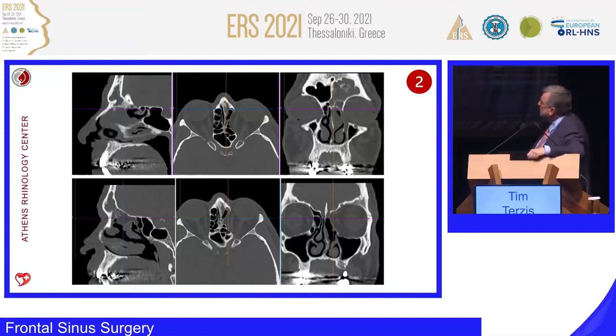So we see the left frontal sinus is obstructed, and we can see the septal body here, quite swollen, no middle turbinate identified on this slide. This is the frontal recess with an agger nasi, and what is this? I mean, we can see this alteration of the anatomy of the orbit here, and we can see that the ethmoids, especially the anterior ethmoids, are obliterated by this fracture of the lamina papyracea. So if somebody tries to get into this ethmoid, it's quite dangerous because he may enter the orbit here. So how would you comment on this?